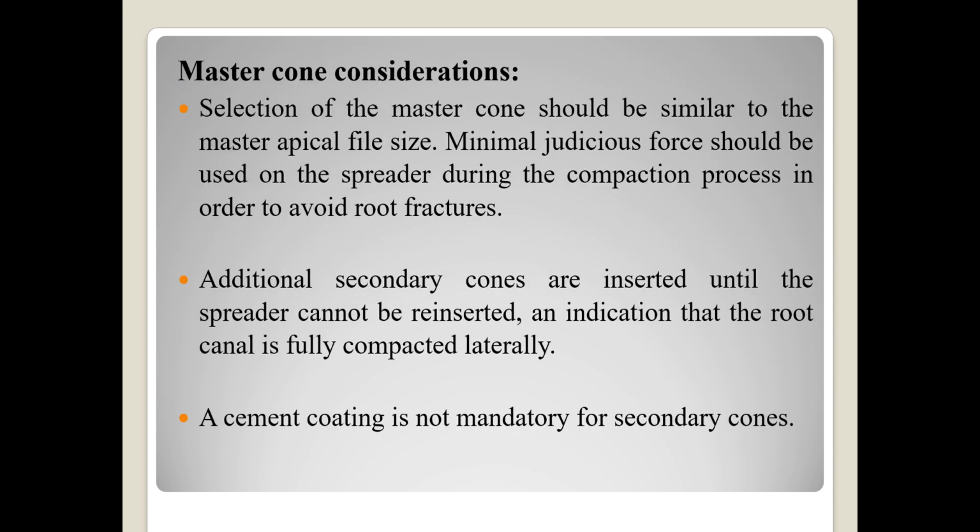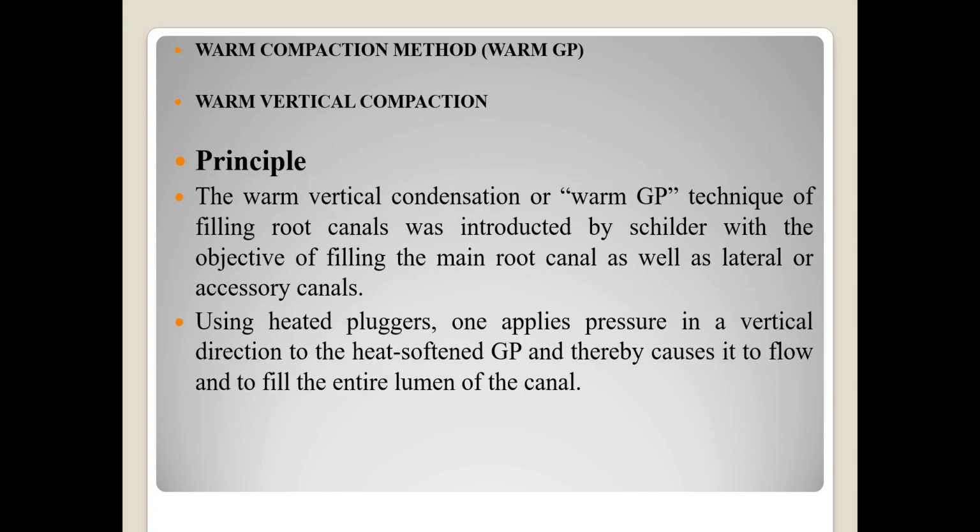Master cone considerations. Selection of the master cone should be similar to the master apical file size. Minimal judicious force should be used on the spreader during the compaction process in order to avoid root fractures. Additional secondary cones are inserted until the spreader cannot be reinserted, an indication that the root canal is fully compacted laterally. A cement coating is not mandatory for secondary cones.